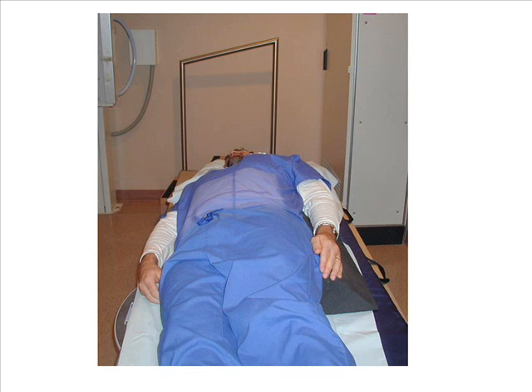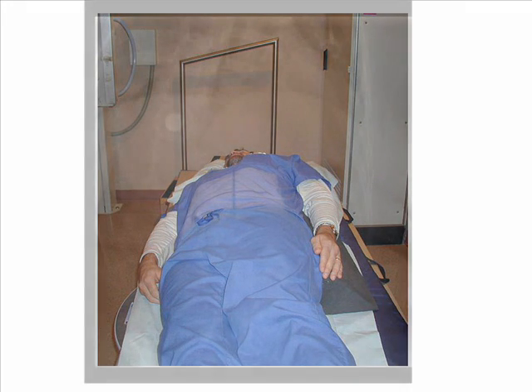Have the patient raise the arm nearest the image receptor and place it under the head to raise the scapula away from the rib cage. Abduct the opposite limb, placing the hand on the hip. Rotate the patient's body to the right or left 45 degrees, placing the affected side closest to the image receptor.